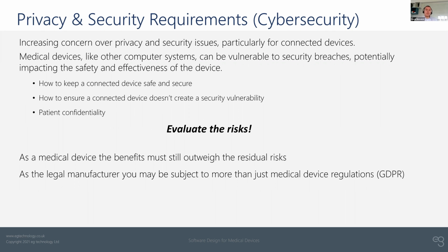And so cybersecurity is really interested in how your system might be vulnerable to security breaches, and they're pretty keen on making sure that you think about all of the potential impacts and all the potential routes into your device, whether it is internet connected, which is an obvious risk, but also if it provides any communication ports that are accessible on the device.